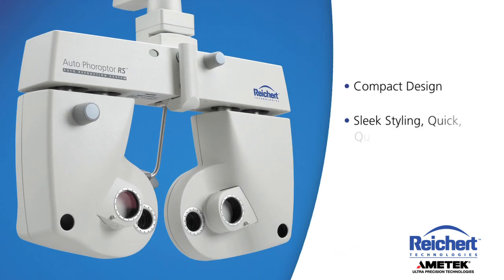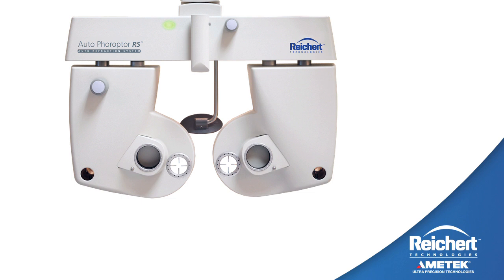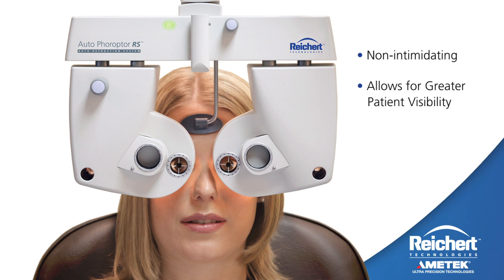The compact design, sleek styling, and quick-quiet lens exchange are unmatched by other automated refraction systems. The Auto Phoropter's compact design is not intimidating and allows for greater patient visibility. Patients will be impressed with the speed of the lens movement and high-tech design.